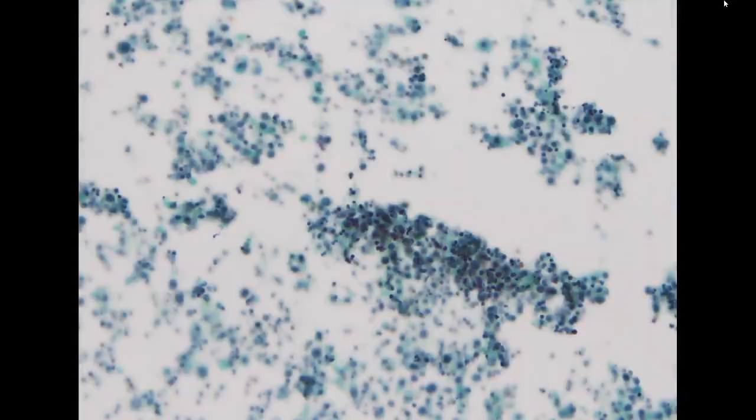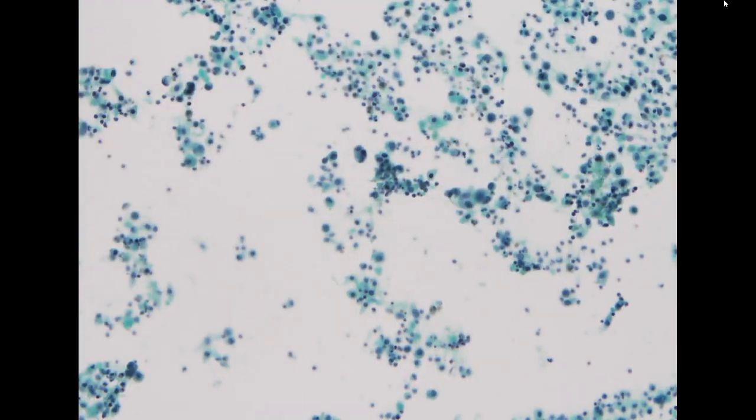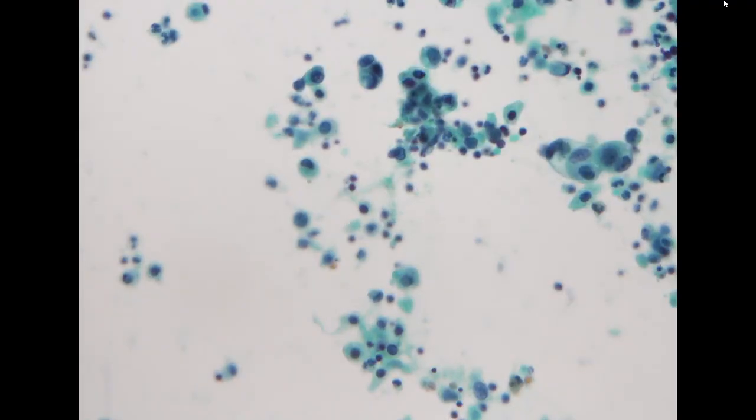Some of the cells have more hyperchromatic nuclei, which is not very typical for adenocarcinoma. In some areas you see this cell-in-cell pattern.